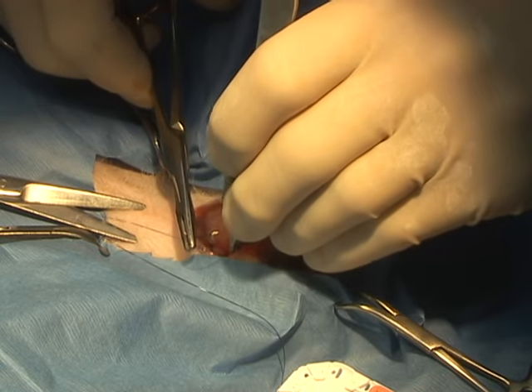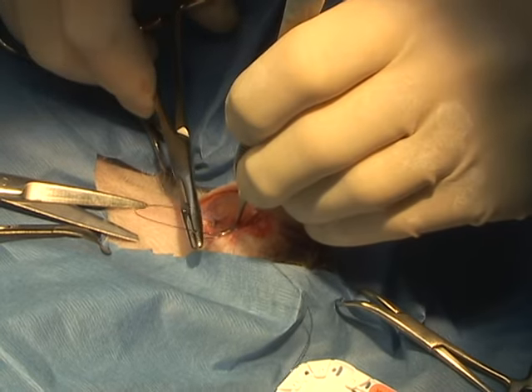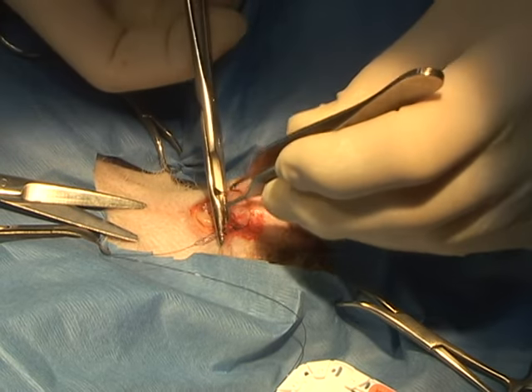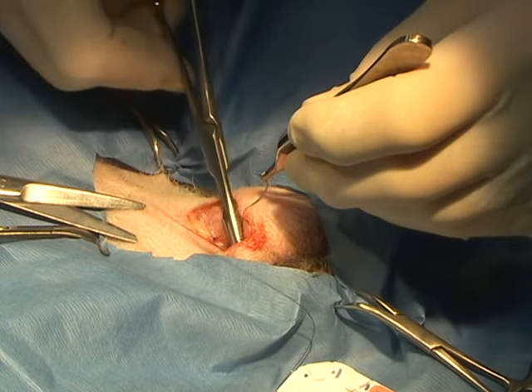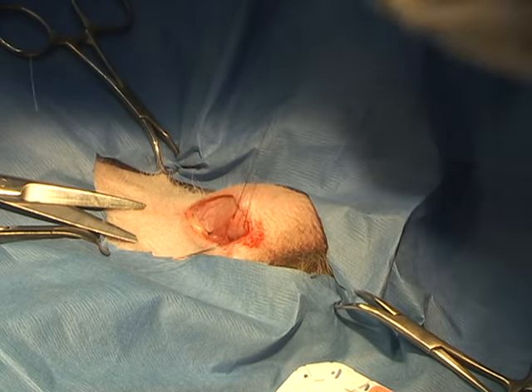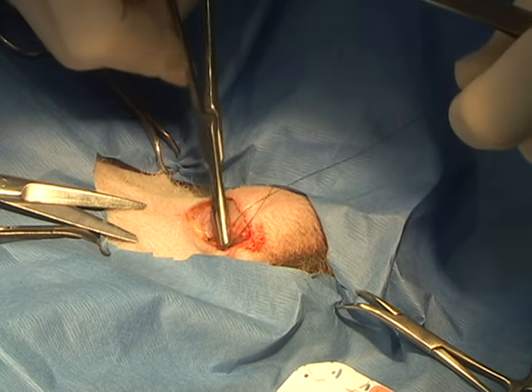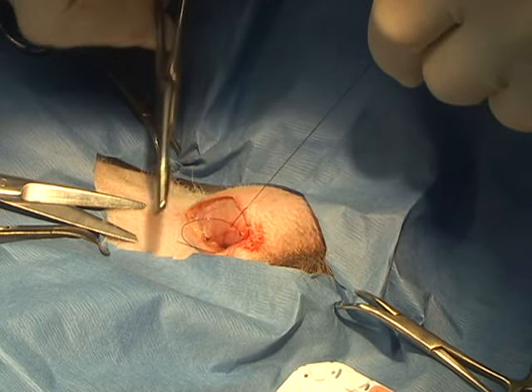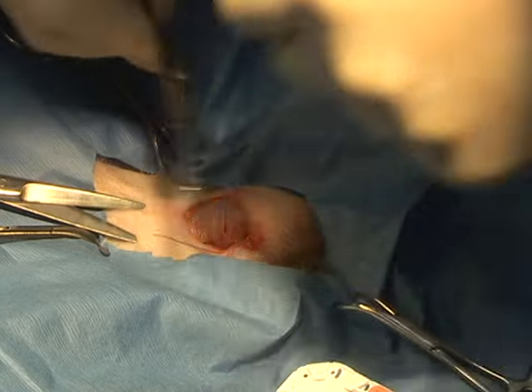You can see there's some edema in the existing testicle as we're working right now. It wasn't expected at the start of this, and the edema was there before we were suturing, so we didn't hit a blood vessel in there. The edema came shortly after we dissected the opening for the second testicle, for the Neuticle, and that was what took several days to retract. It was about 2 days, and it was back to normal completely.